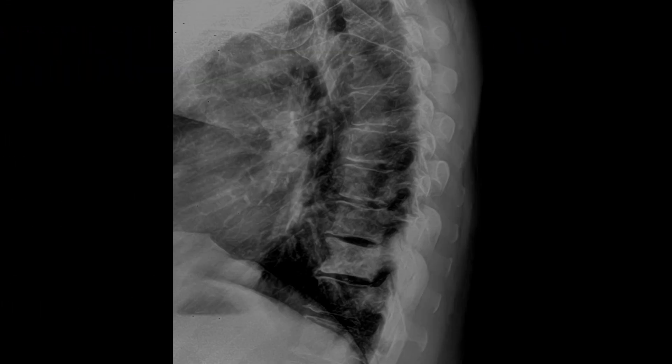You'll notice on this lateral thoracic radiograph that there is one thoracic segment that is different than the rest. There is an increase in density of the T10 vertebral body and posterior elements, suggestive of an ivory vertebra. With the addition of advanced imaging and laboratory analysis, the diagnosis was determined to be underlying blastic metastasis.